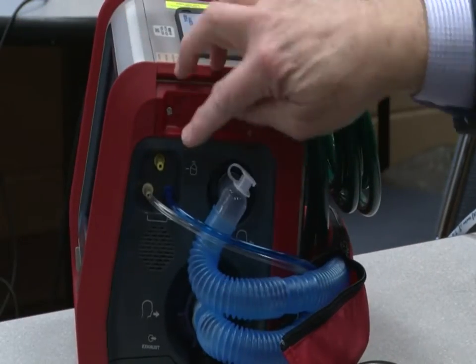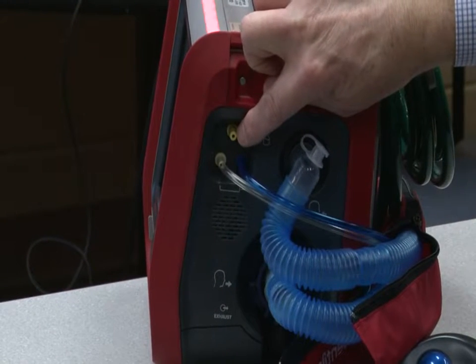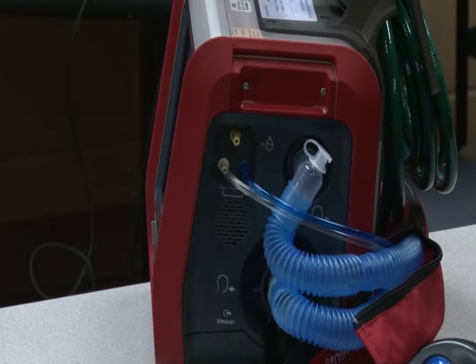The yellow port on the side of the ventilator is for a nebulizer. The best place to put that would be between the circuit and the flow sensor. Depending upon which nebulizer you use, you might need a couple of adapters, so that would be something to look at.